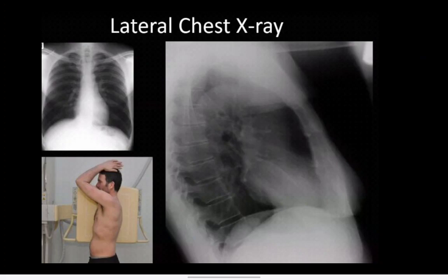The normal chest radiograph can visualize the lung fields with the heart in between and the mediastinum. This is the bone of the sternum and manubrium sterni above it. Also, we have the thoracic spine posteriorly.